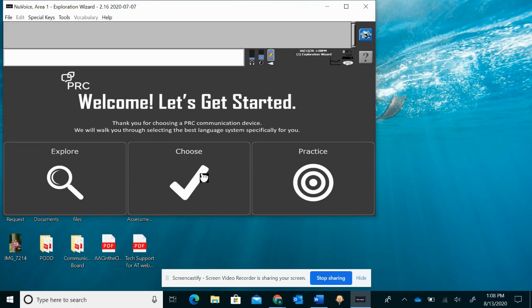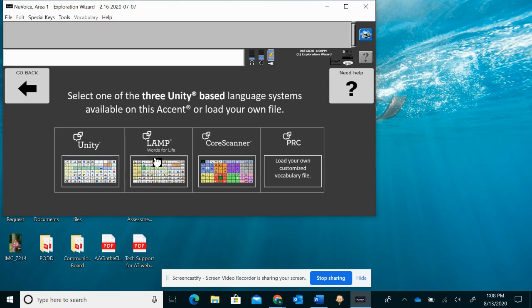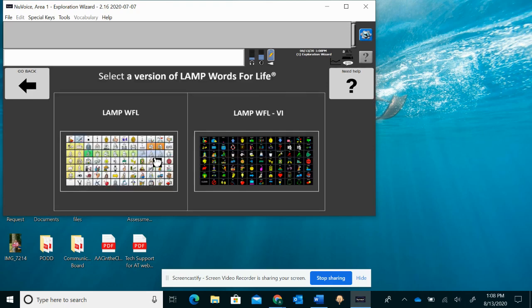I'm going to do choose since I know which one I would like to open. You'll see again it has unity, lamp, core scanner. I'm going to choose lamp for now. And you can always go and do vocabulary and change that at a later time.